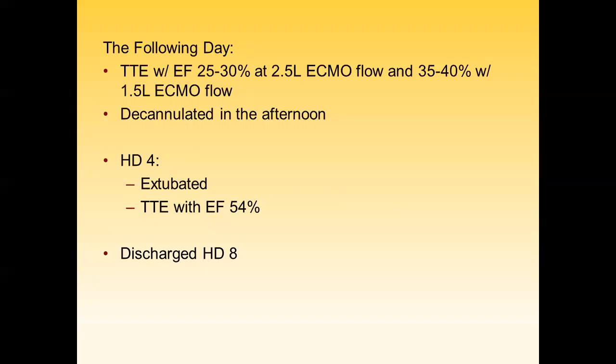So the first one is the decannulation. For the most part, we will surgically decannulate, though we've now done one bedside decannulation with a 15-French arterial cannula in a person who is a great candidate, very skinny, good compression, needle stick was great. So we will likely do more bedside decannulations in the future, but it will be selective. The tradition here has been all surgical.